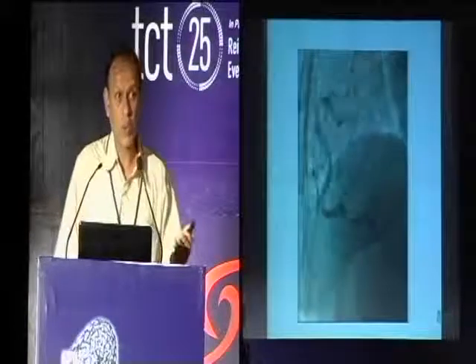So what you think is coaxial in the LAO view probably may not be coaxial in the RAO view. So if you are taking a procedure and you think your angulation is not correct, probably you need to go to the RAO 30 view and take a view and decide if the guiding catheter is coaxial.